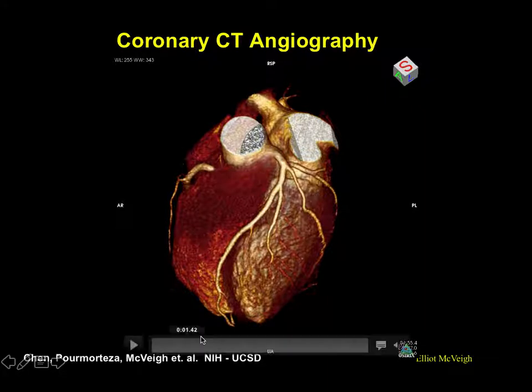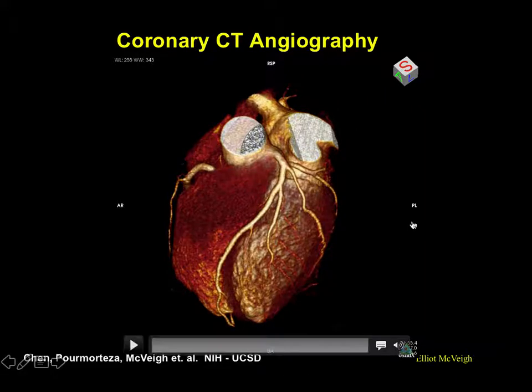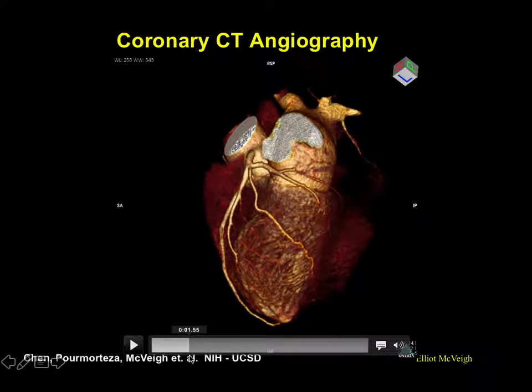People very rarely use these diagnostically. Interestingly, they basically don't count on these for making a call. They look at these to determine whether or not the study itself has reasonable image quality, because you can see the entire field of view instantly, and you basically rotate around and go, oh, this is a good study. And then they go to the axials and make the diagnosis, right?